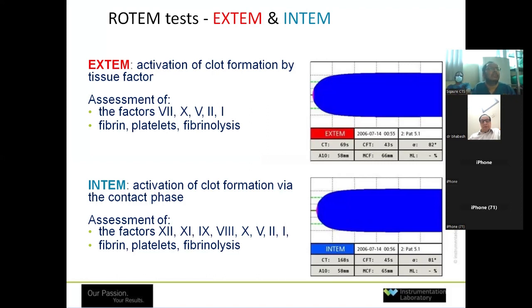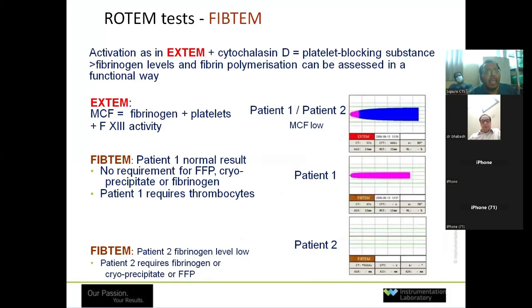INTEM is activation of the clot formation via the contact phase, assessing factors 12, 11, 9, 8, 10, 5, 2, 1, fibrin, platelets, and fibrinolysis.